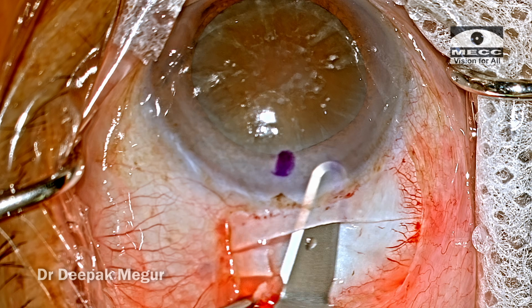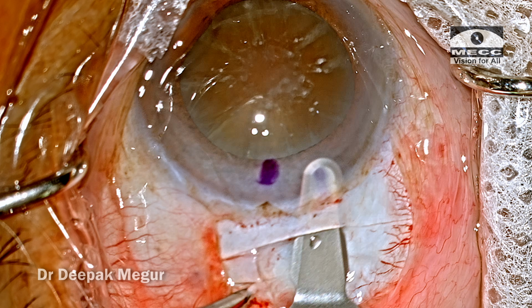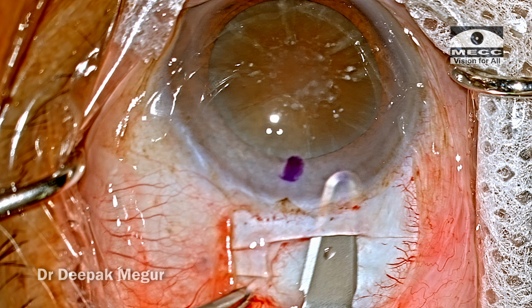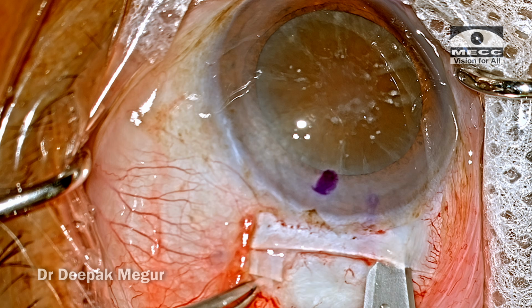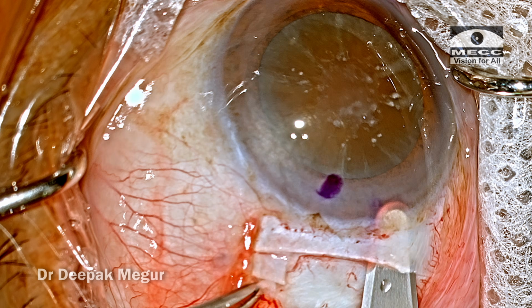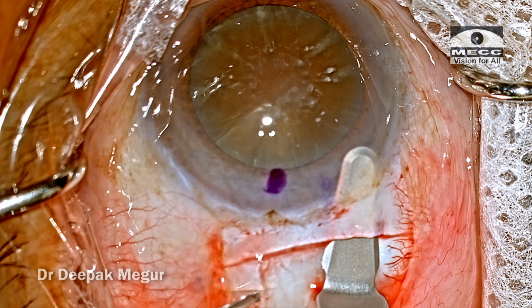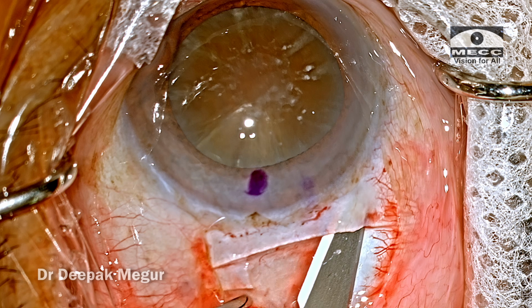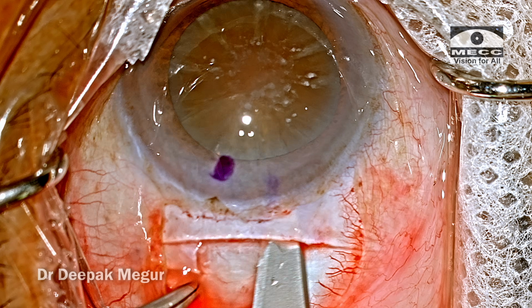It's important to understand the concept that the extension of the tunnel into the cornea is critical. We need to have the inner lip at least 1.5 mm from the limbus, and it has to be in a curvilinear fashion. The internal incision always has to be like a smile with at least some amount of corneal tissue away from the limbus until the peripheral part.